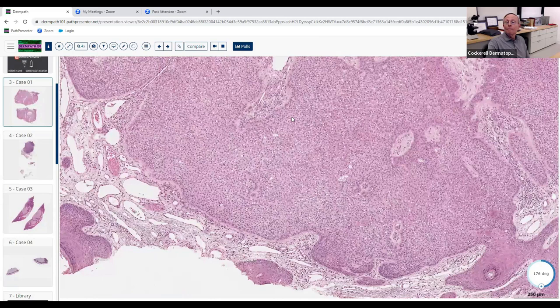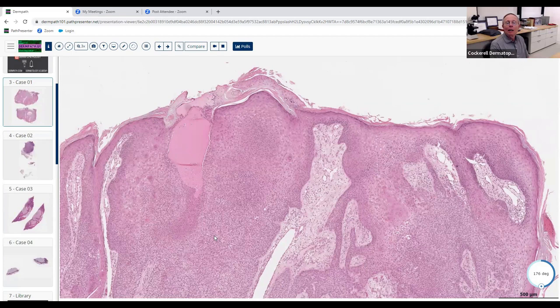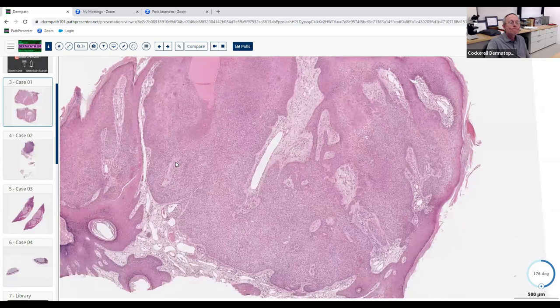So what else is in the differential? You could think of a clear cell acanthoma, but that typically doesn't create a huge tumor like this. Clear cell acanthoma actually looks a lot like psoriasis — it's a small papule with little bulbous epithelial proliferations and overlying parakeratosis with neutrophils. You never make a large endophytic neoplasm like this with clear cell acanthoma.